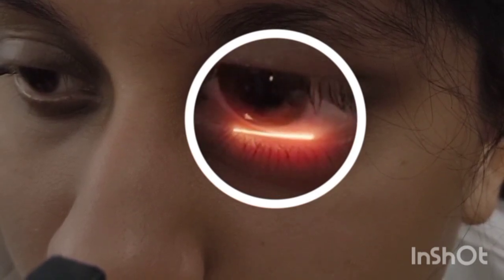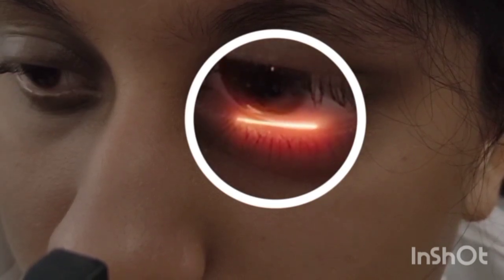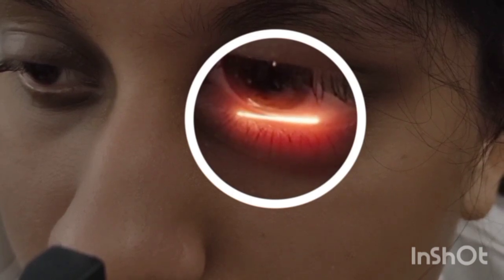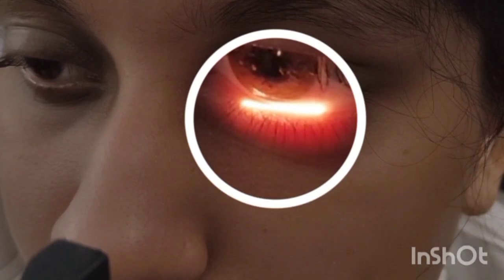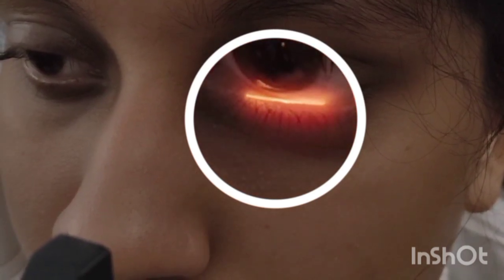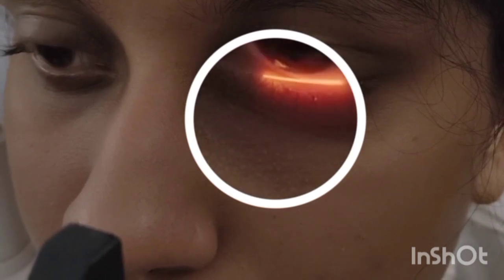So now we just want to measure the height of this tear fluid. Okay, so from this lower eyelid margin, how much of the tear fluid is located. Firstly, we need to align the slit with the height of the tear fluid or tear meniscus. Okay, so now you can see that it is a little bit aligned. Now from this slit lamp alignment scale, we will directly measure how much it is. It is nearly about 0.2 millimeter. The normal range of this tear meniscus height is around 0.2 millimeter to 1 millimeter approximately.